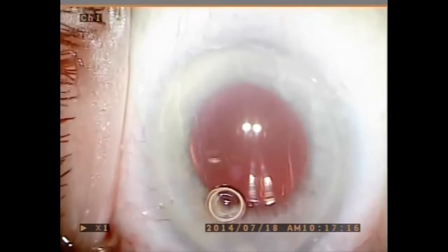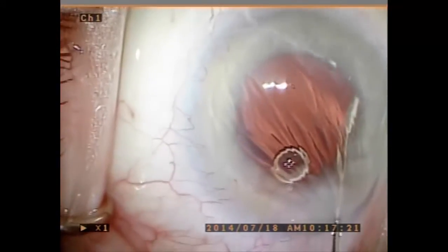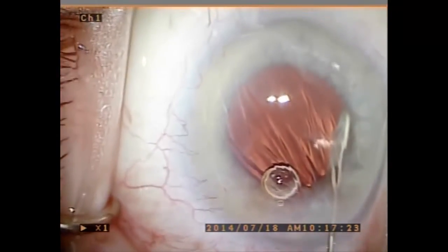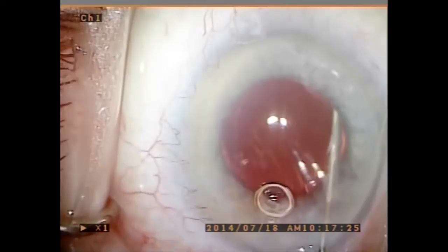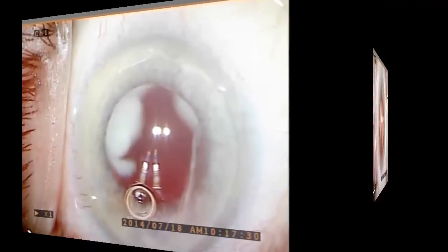A Rycroft 30-gauge cannula is advanced through the inferior zonules from its tip to its 45-degree bend, which is approximately 4 millimeters. Then 0.2 cc's of Trimoxy Vanco is slowly injected into the anterior vitreous.